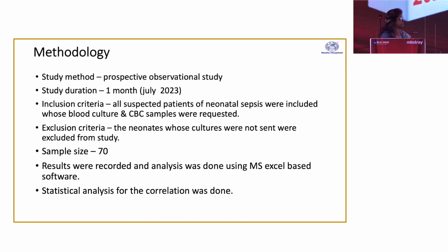The methodology we used in this study was a prospective observational study. Study duration was 1 month, July 2023. Inclusion criteria: the patients whose CBC count and blood culture sample we received were included, and those for whom one of them was not received were excluded. Sample size was 70. Results were recorded and analyzed using MS Excel based software. Statistical analysis for the correlation was done.